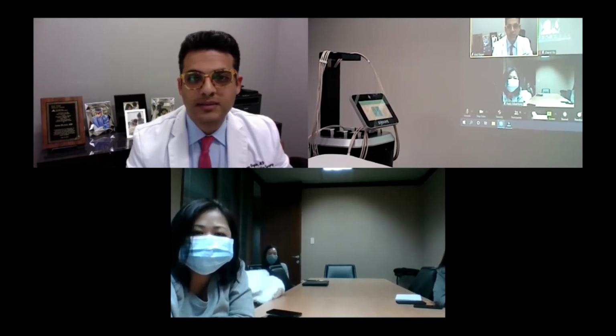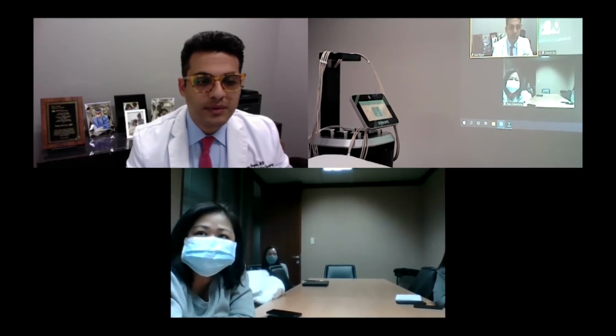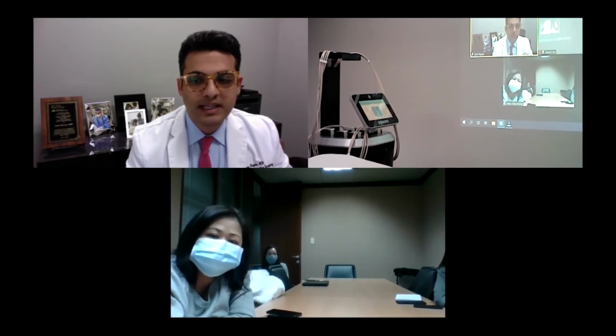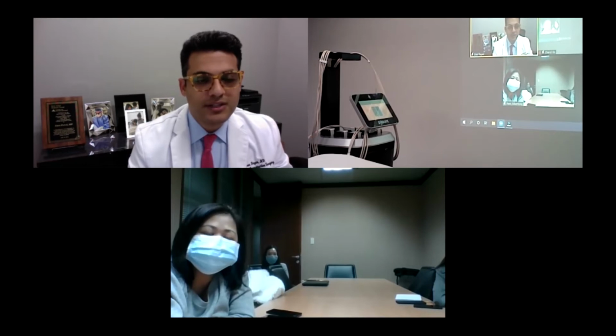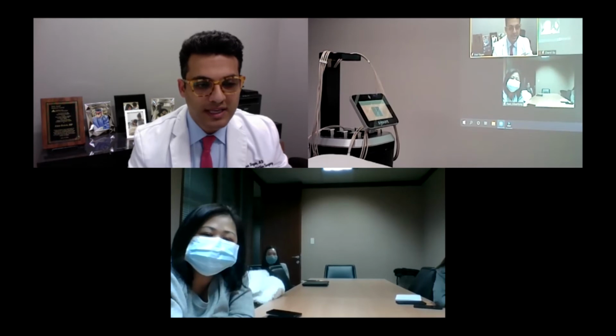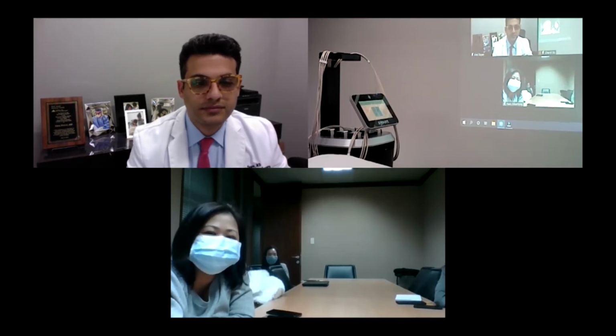And one other thing I wanted to mention, which I didn't really touch on, as far as sequence of treatments: if we're going to do electrical muscle stimulation, we typically like to preheat the muscle before, because we get a better muscle stimulation. Patients really understand it, they understand hot yoga. Patients go exercise in hot rooms. So they're very amenable to this concept of first applying radio frequency heat that's bulk heating the tissue and then performing electrical muscle stimulation. So that's typically our sequence. So that's like tenderizing the meat.